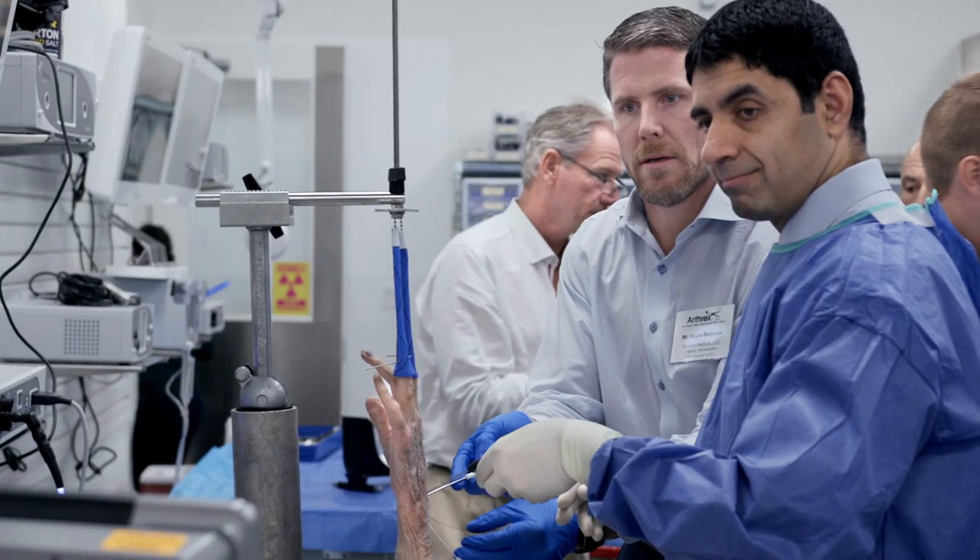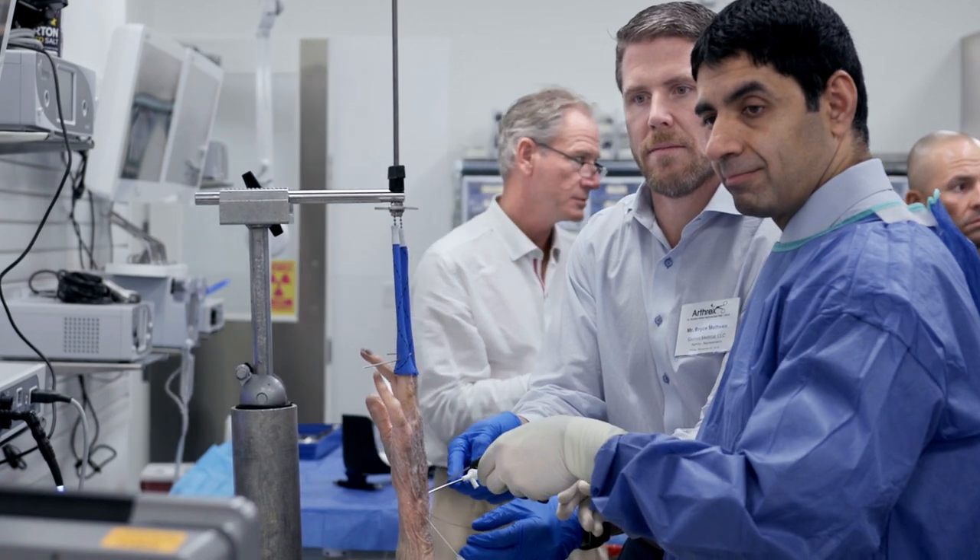You can put it anywhere in the wrist, you can put it in the thumb, you can put it in the MP joints or the DRUJ.